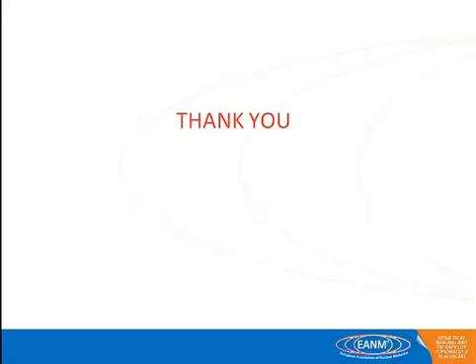Thank you for your talk. May I ask you how many CT slices you're using for your clinic, your lab? For respiratory gating, yes? We use, I think, 1.25 millimeters, so it depends on the model of the machine. It's 1.25 thick slice.